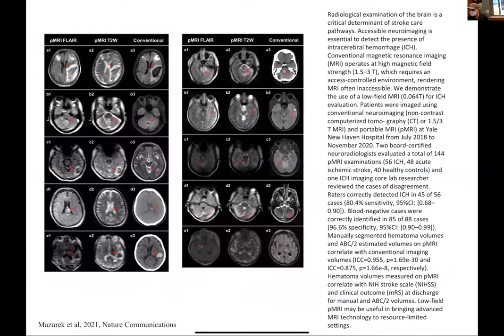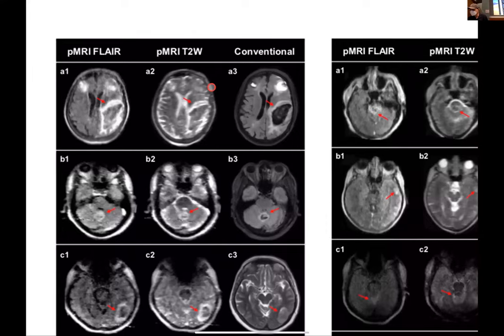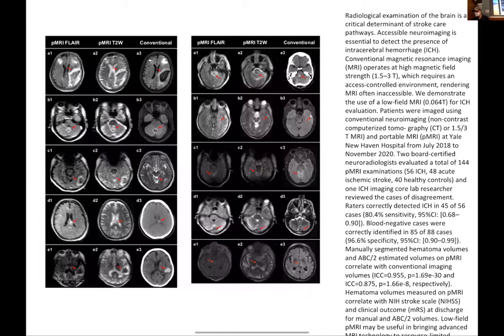These are some images, just showing what the images look like off their scanner. So this is like a T2 weighted. Unfortunately, in this paper, they compare against things with different contrasts. So this is probably comparing this to this. This is the FLAIR, right? So you can see it's not as good. I don't see as much detail, but certainly for this person, they're looking at hemorrhages. You can see on the T2 weighted there's clearly a lot of fluid here, right? That's going on, long T2 something. So clearly this is sufficient to tell that something's wrong with this person, versus this, which is the expensive MRI.